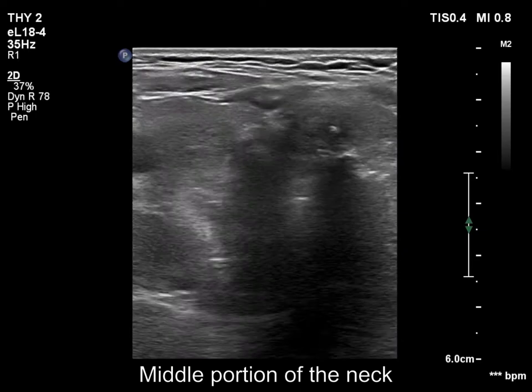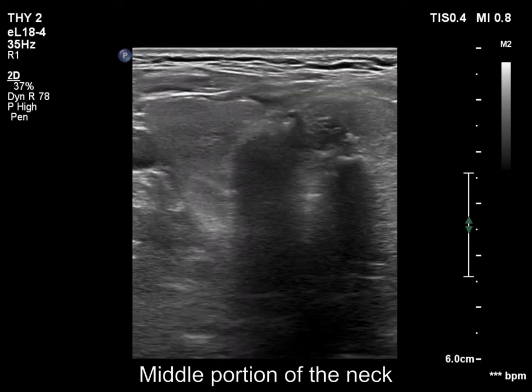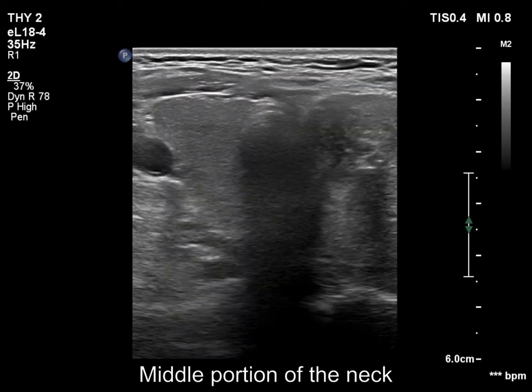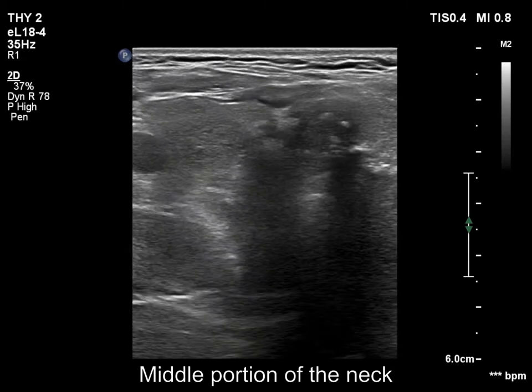Finally, the compression of the trachea is demonstrated. The trachea is compressed along its entire length.